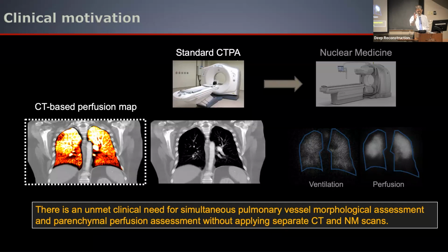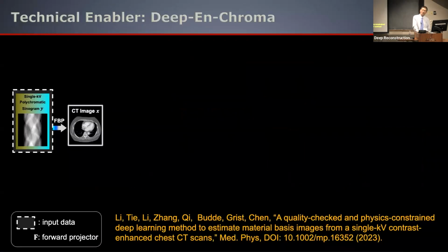But don't get me wrong, that doesn't mean nuclear medicine is not good. We are just asking what is the best clinical workflow. That is what we're talking about. So this motivated us, in fact for 5 years, to think about how to leverage the super powerful computational platform offered by computation capability and deep neural networks to accomplish that. So we tried many turns and failures and finally came to the idea.